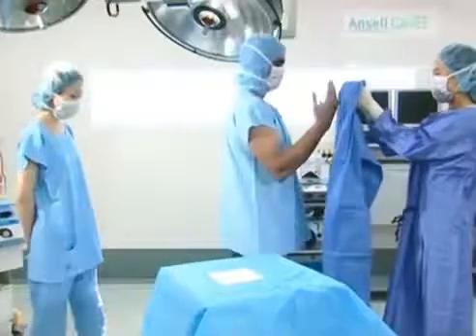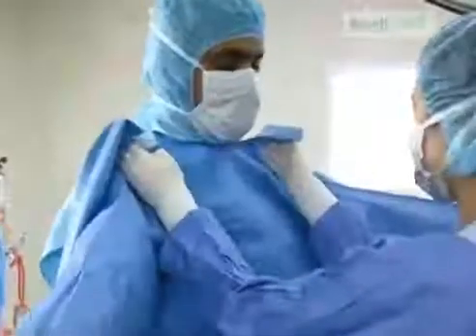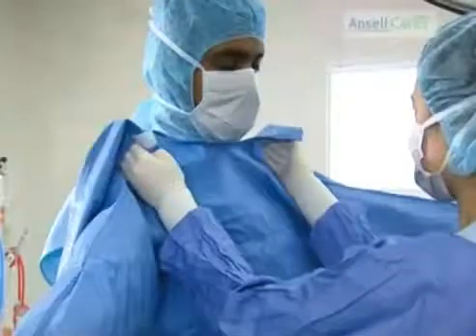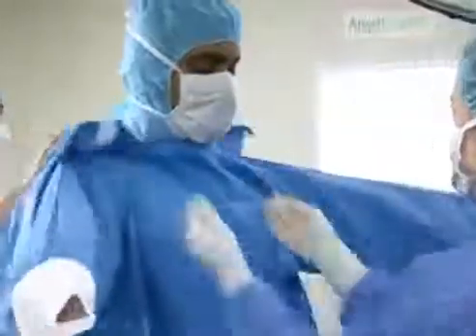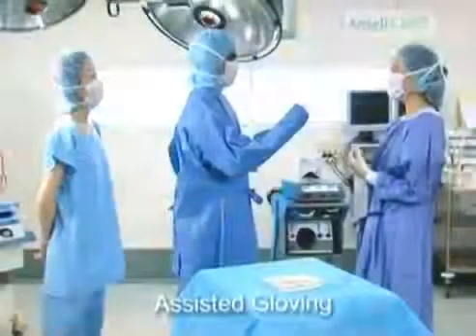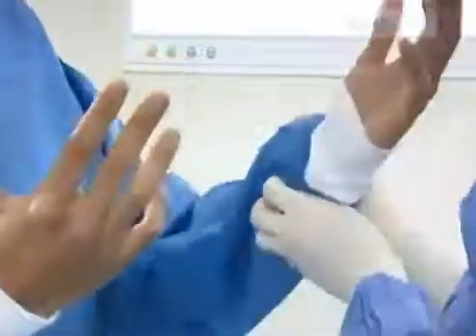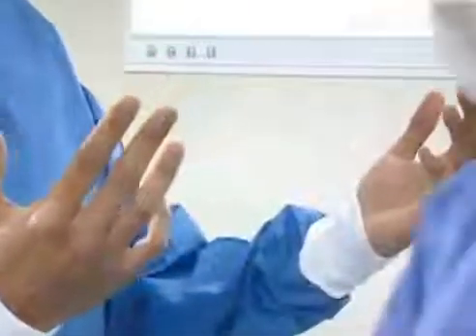The surgeon steps forward and places his arms in the sleeves. The gown is pushed halfway up the arms. The circulating nurse, from behind, grasps the neckties and pulls the gown into place. She then ties the ties at the neck and waist. To expose the surgeon's hands, the scrub nurse carefully pulls the gown cuffs back to the wrist.